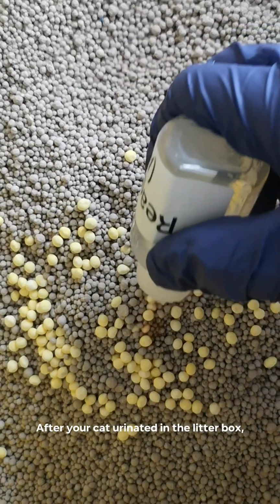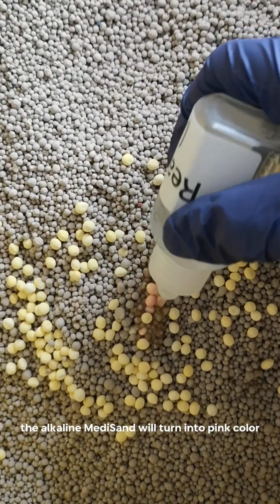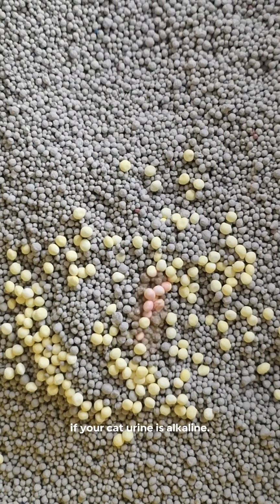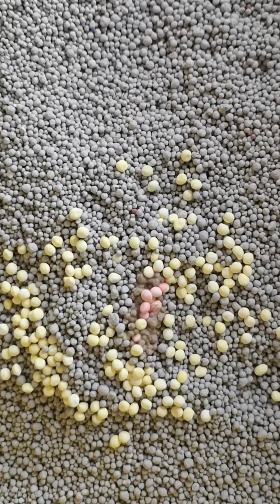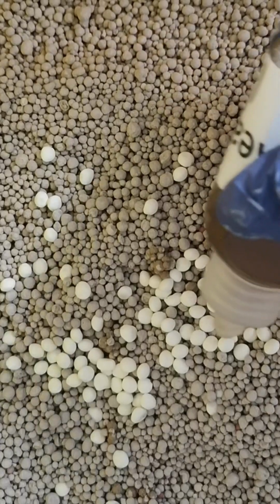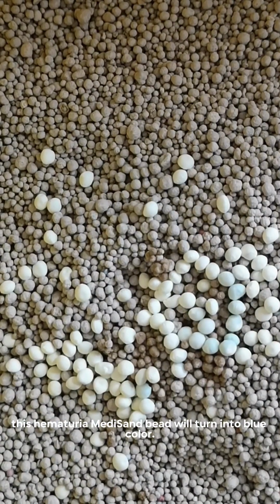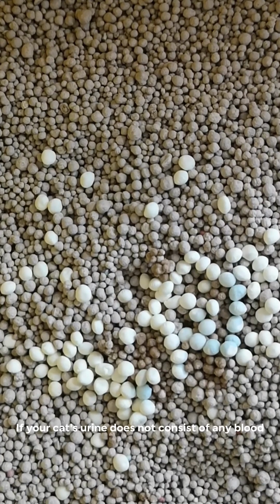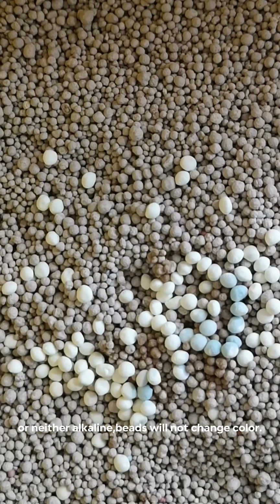After your cat urinates in the litter box, the alkaline Medisand will turn pink if your cat's urine is alkaline. If your cat's urine contains blood, this hematuria Medisand bead will turn blue. If your cat's urine does not contain any blood and is not alkaline, the beads will not change color.